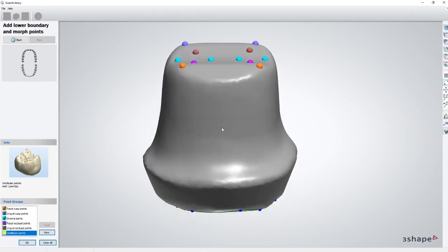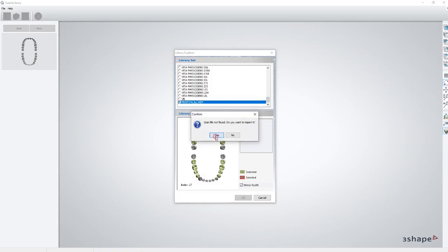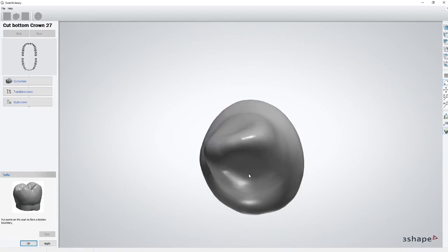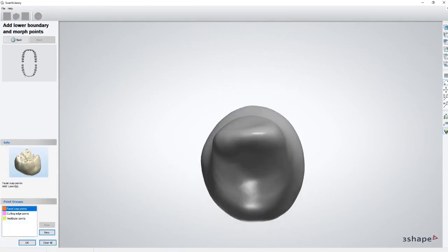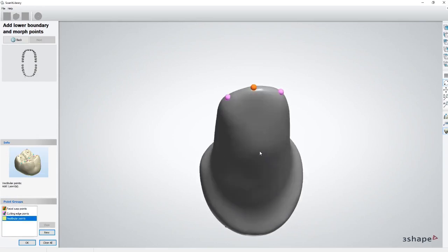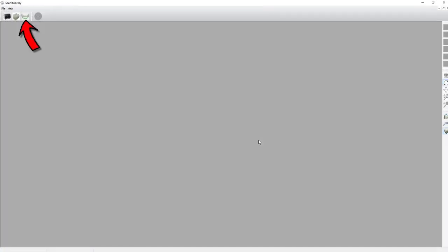So I have to complete this task for every single tooth. Now I'm going to click on the little tooth again and import the DCM file. In this case it's a canine, just to show you that there are fewer points, just the incisal points and the vestibular point. And that's it for the canine. And then I go back and now I can create the smile library.